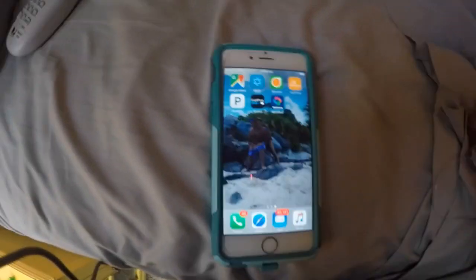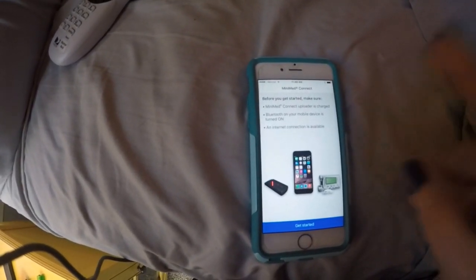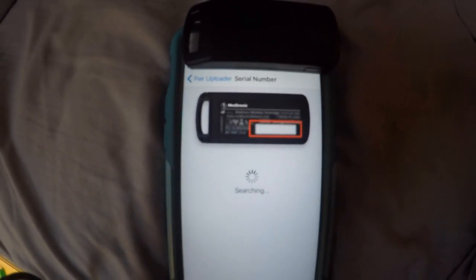I'm still having issues with the Medtronic MiniMed Connect app. I've deleted and reloaded it twice. It tells me to press the button on the uploader for three seconds until the blue light blinks — I've done this many times. I do it again, see the blue light blinking, hit Search with the uploader directly on the phone. It still says uploader not found — make sure uploader is in range and blue light is flashing.